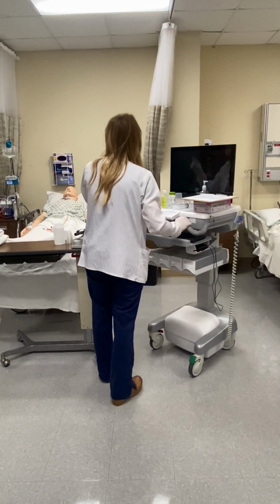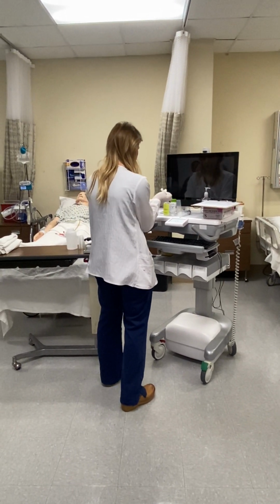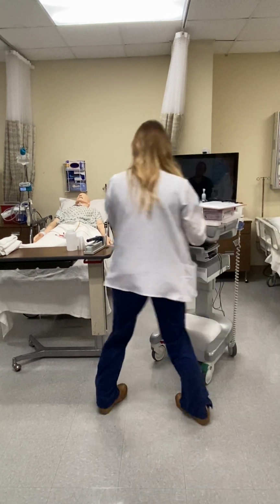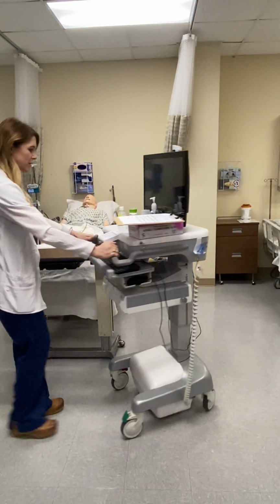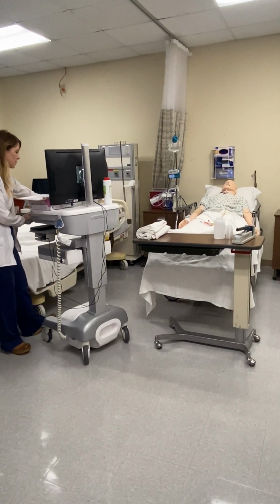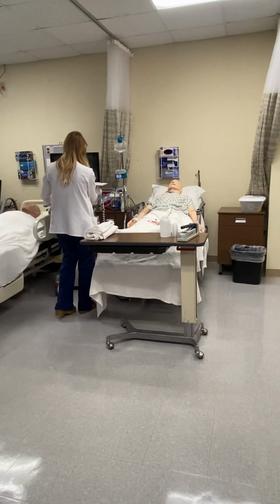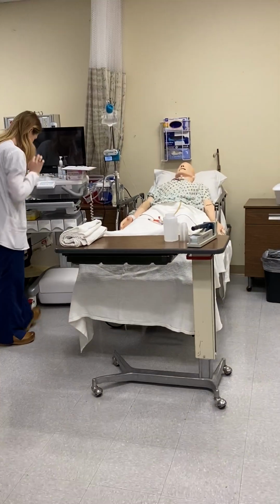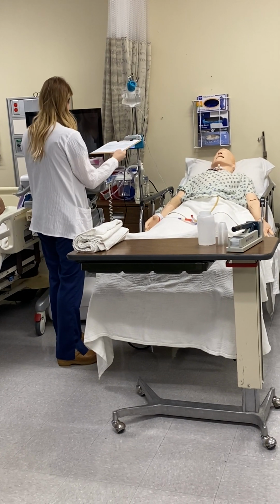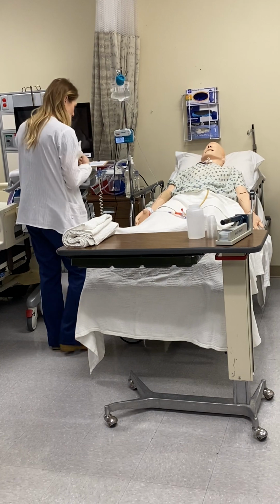So now I'm at the door. I've got room 2, Mr. John Smith. Let me take off my gloves and clean my hands again. And I'm going to go to this side since that's where that pump is. Hi, Mr. John Smith. I'm here to give you some medications through your PEG tube. I'm going to clean my hands and get some gloves on, but in the meantime, can you give me your name and date of birth?